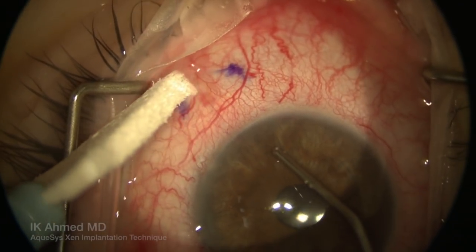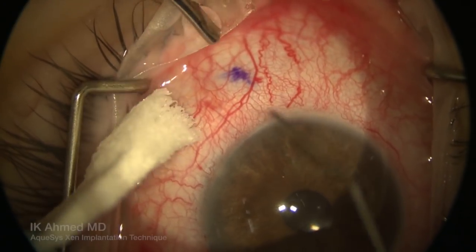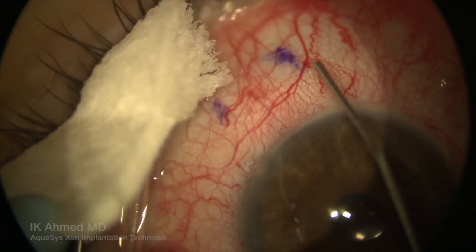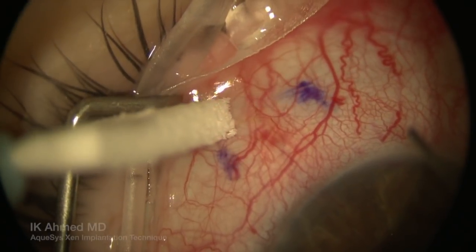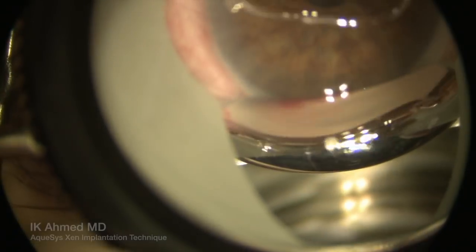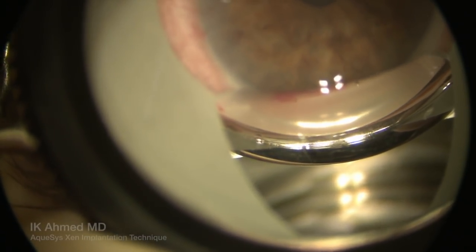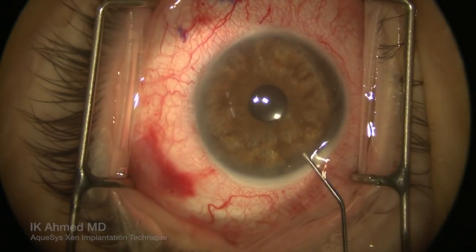Looking closely at the subconjunctival space, we'll see that the implant emerges three millimeters posterior to the limbus as planned. We see a slight curve of the implant in the subconjunctival space pointing nicely to the superior quadrant, and we see how softly the implant lies underneath the conjunctiva. Here's a gonio view of the implant in the anterior chamber, showing nice position, entry at the meshwork away from the cornea and parallel to the iris.